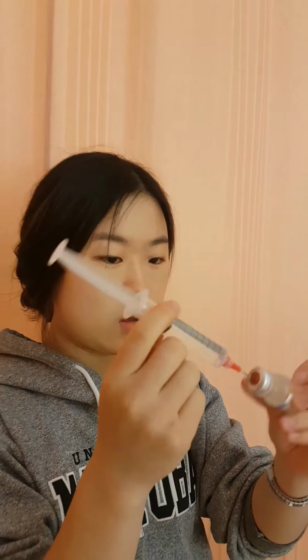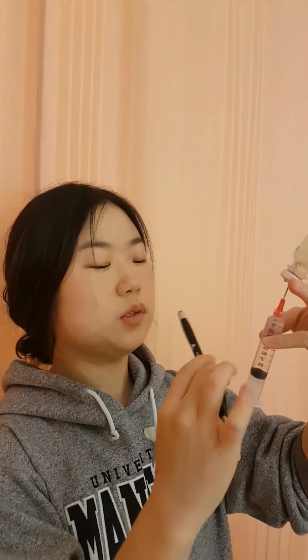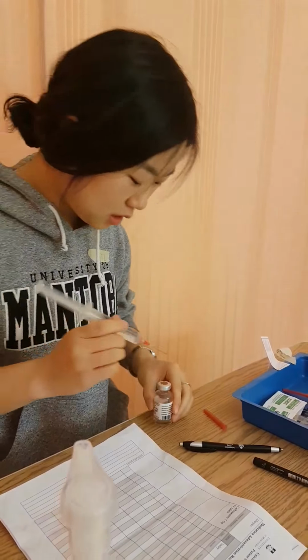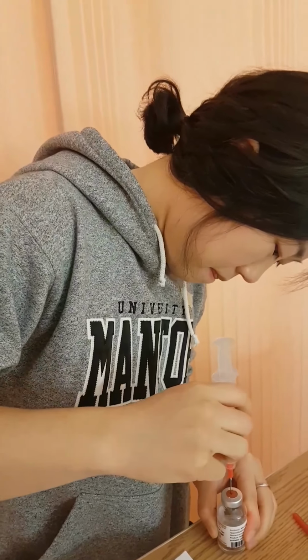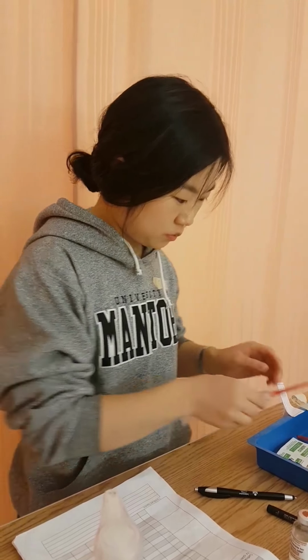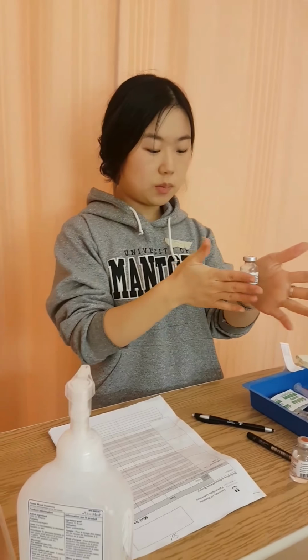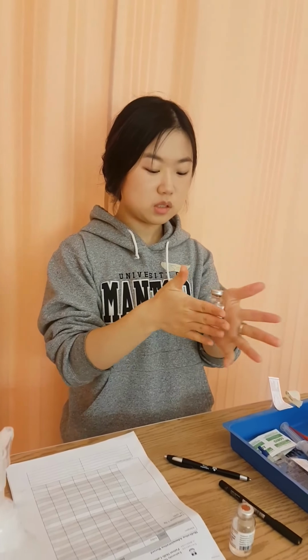Getting rid of the air bubbles. I'm going to inject it into my second vial. All right, I'm going to safely recap this. And I'm going to roll these so that all the particles get dissolved. And it looks like a clear solution. And I'm also being careful not to touch the tops while I'm doing these.